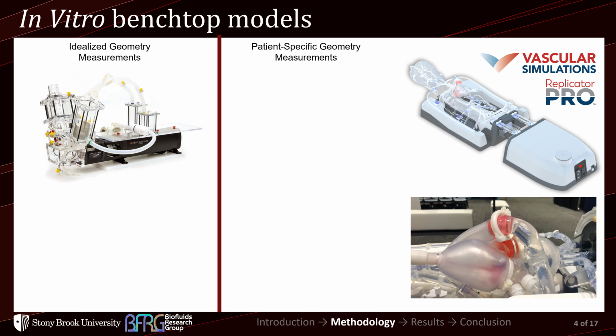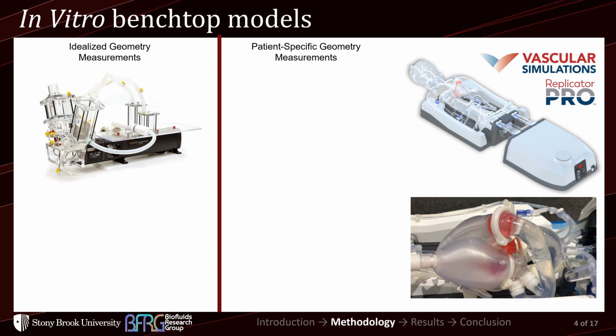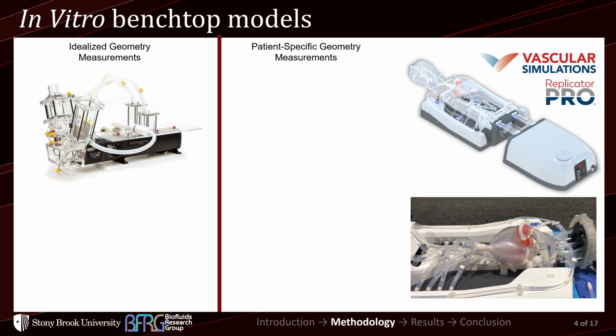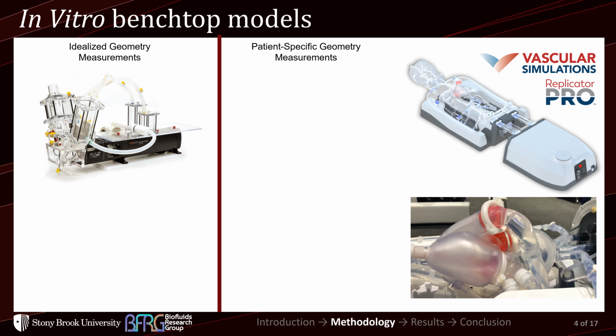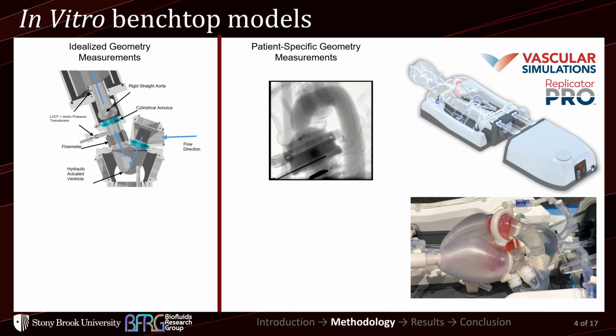It offers a pretty unique platform in which we can simulate an entire procedure on what we deem as a patient, even though it's a plastic and silicone patient. It contains a functional left heart. The heart is actuated pneumatically, and everything is controlled through an adaptive feedback mechanism.